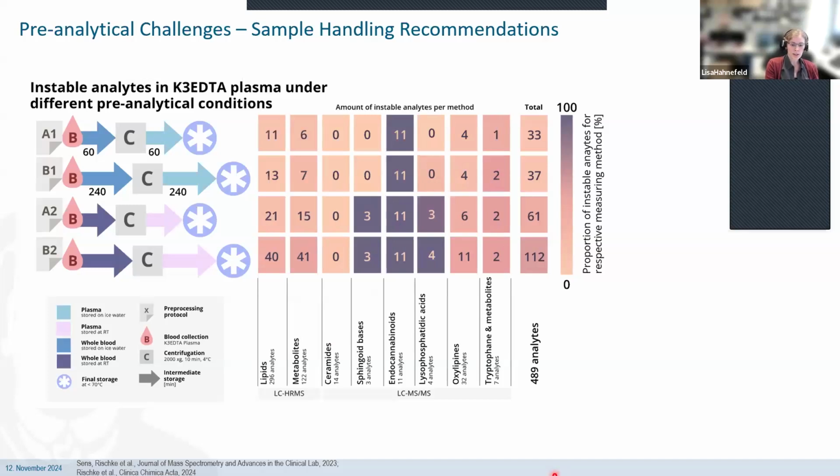For this, we first tried to think of which protocol would make sense in most clinical settings, also in a study which encompasses different study sites. And for this, we thought that 60 minutes each was a suitable time. So we have some collaborators who also managed to do the complete sample processing until freezing in just 20 minutes, including 10 minutes of centrifugation. But this is just one study, and you have to be really, really on time for this. So 60 minutes, I think, should be feasible.